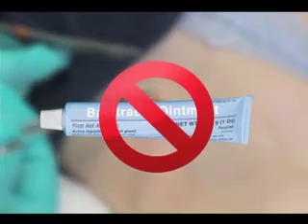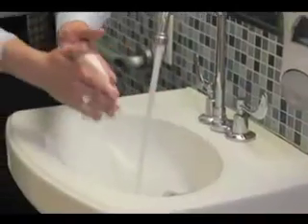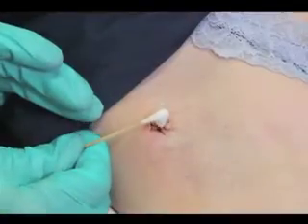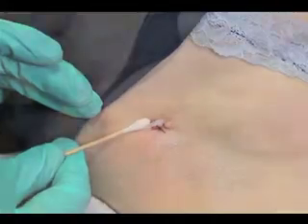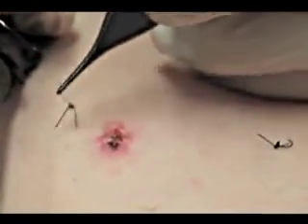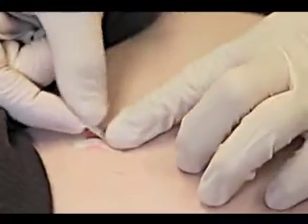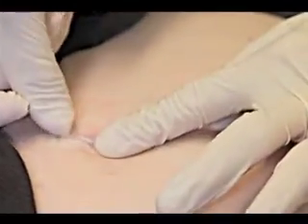The application of a topical antibacterial agent after a punch biopsy is discouraged because allergic reactions are common. The biopsy site should be cleaned with soap and water twice a day. After cleaning, petroleum jelly should be applied to aid healing. Sutures should be removed, if necessary, one to two weeks after the procedure depending on their location. Sutures placed on the face should be removed within one week, and sutures on other parts of the body should be removed within 10 to 14 days after the procedure to minimize the risk of track marks and scarring.